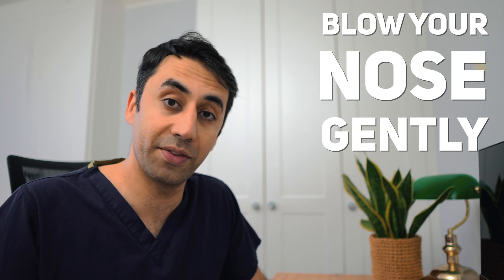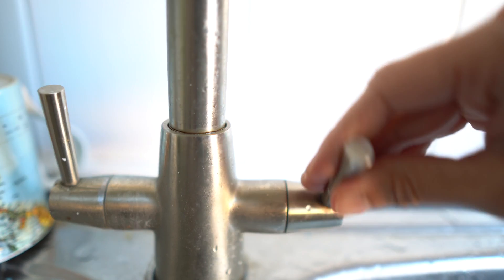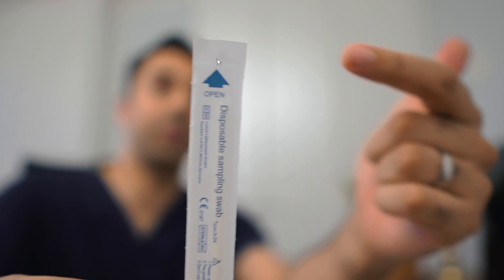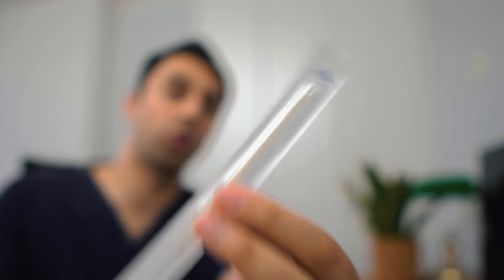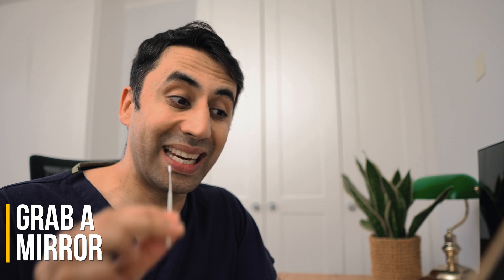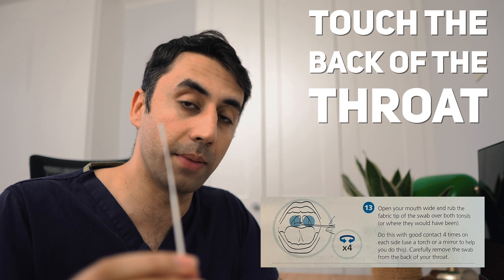Blow your nose gently and then wash your hands afterwards. Find the swab and open it from the side that has the arrow — that's the side you can touch, and the other side you should not touch. Grab a mirror, and then take that same swab without letting it touch your teeth or tongue. Put it into the back of your throat and touch the back of the throat where the tonsils are on each side, four times.